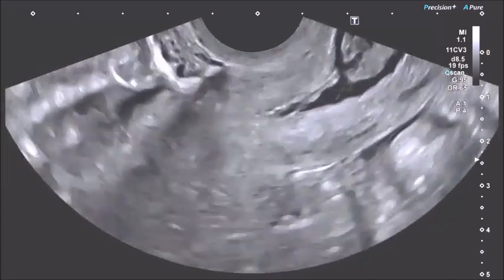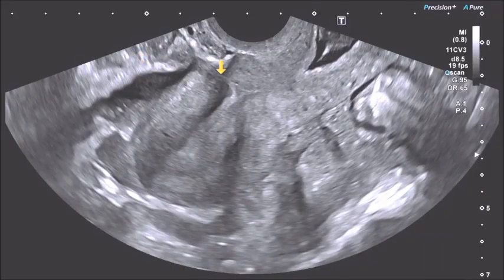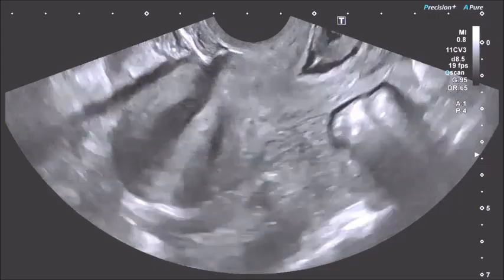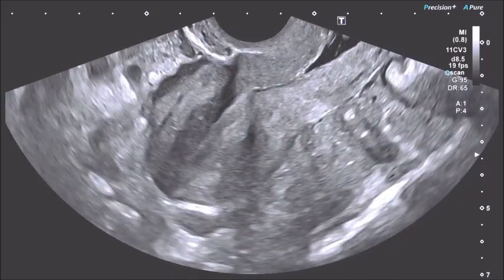The examination continues with the ultrasound, which reveals a uterus that is not particularly fibromatous, but it does present with the very typical finding of what is known as an axe blow appearance that deforms the endometrial lining, a characteristic commonly seen in cases of a previous caesarean section.